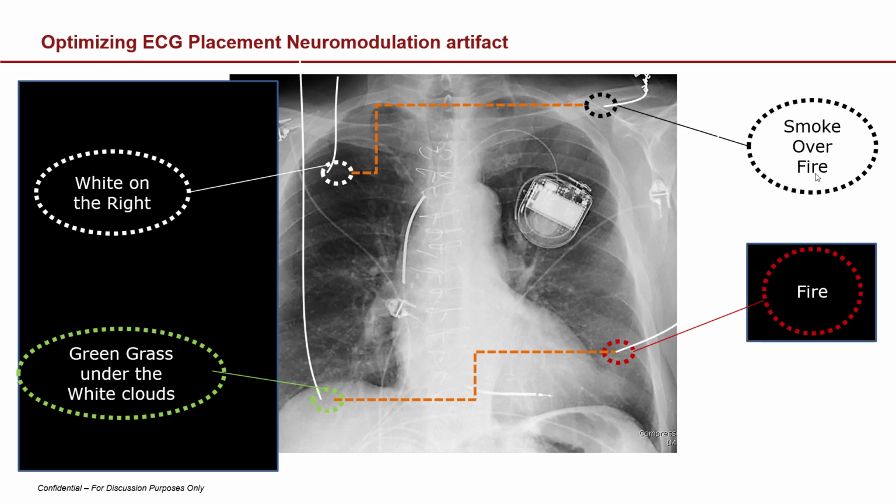Bring your ECG, your black lead, on the arm if you had, for example, a pacemaker where those leads are conducting electricity. So this is a great way to adjust for that electrical interference. And you could go as high as the bicep and still get good information in terms of when to adjust and modulate the exposures based on the automated settings that you either program or the vendor programs on your behalf for your modulation settings.